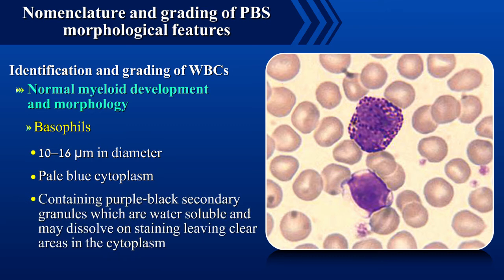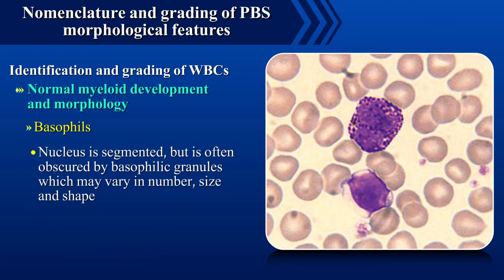Basophils are 10 to 16 microns in diameter with pale blue cytoplasm containing purple-black secondary granules which are water soluble and may dissolve on staining, leaving clear areas in the cytoplasm. The nucleus is segmented but is often obscured by basophilic granules which may vary in number, size and shape.